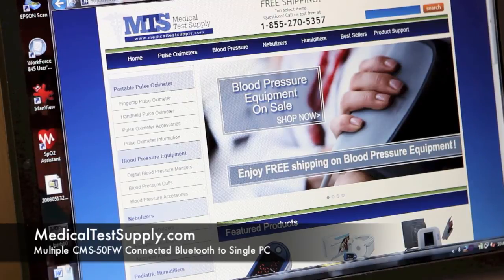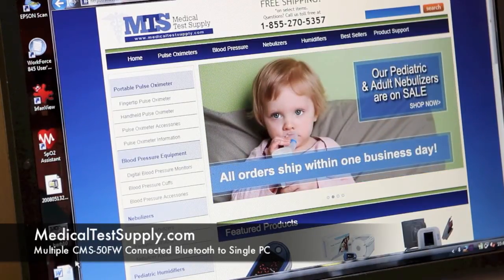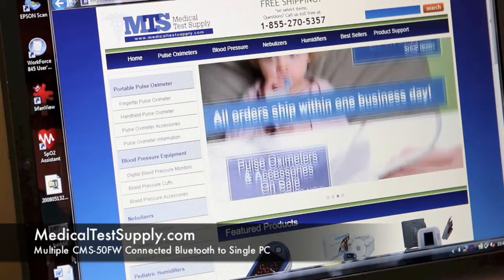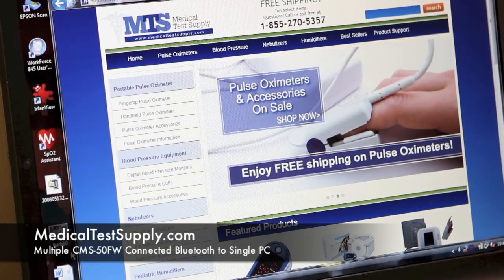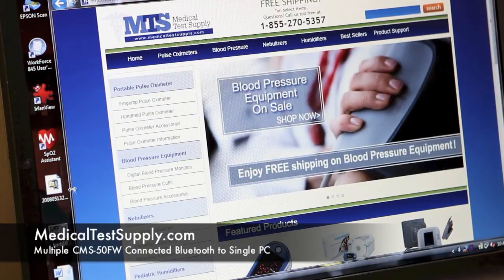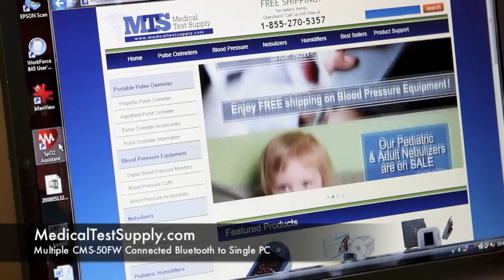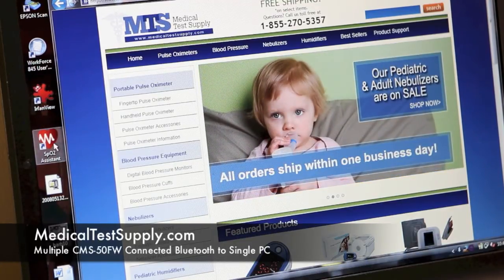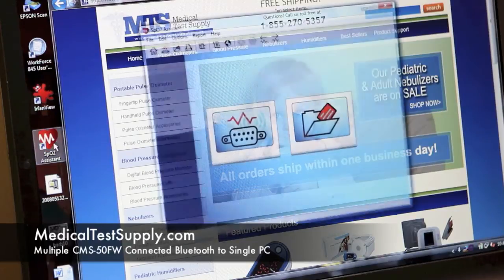We've paired four CMS50FWs with this laptop and we've got the Bluetooth turned on. While we were at it, we renamed the ID of each of the four — you'll see user 1, user 2, user 3, and user 4. To monitor all four on the same laptop simultaneously, we'll open four instances of SP02 Assistant.